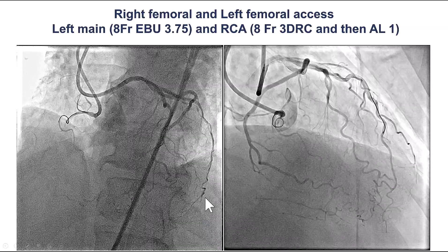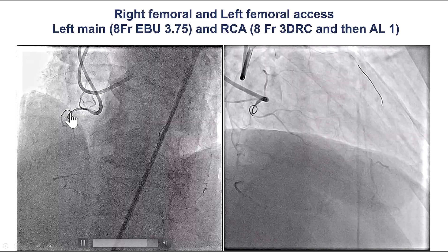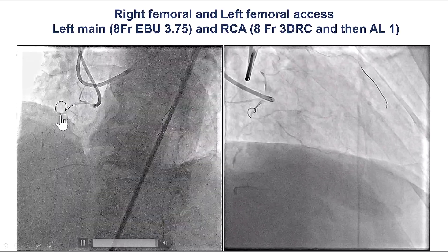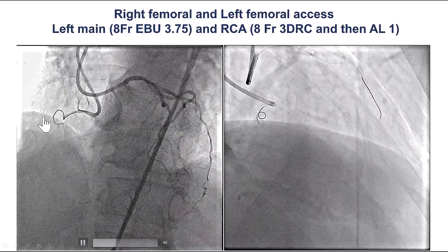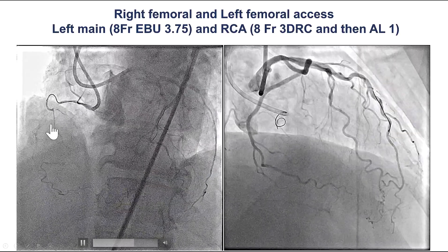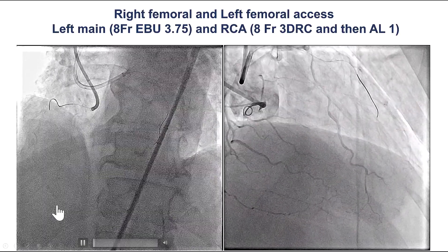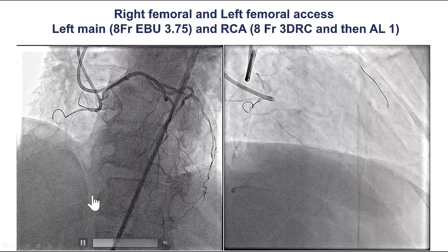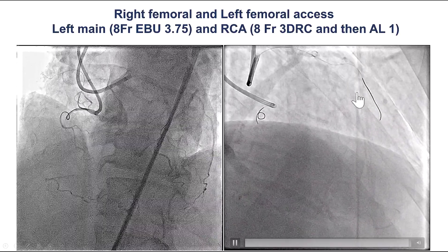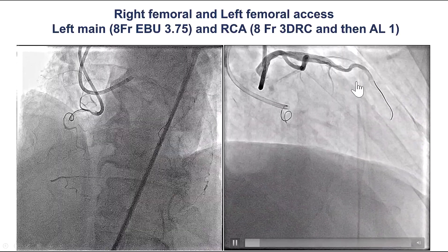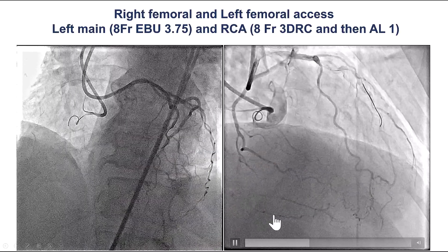This is the dual injection. He did have a CTO with an ambiguous proximal cap at the takeoff of an acute marginal branch. The occlusion length was relatively long, the distal vessel appeared to be diffusely diseased, and there appeared to be septal collaterals and epicardial collaterals supplying the PDA.